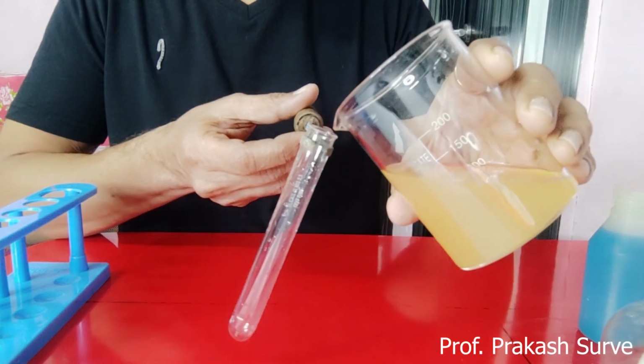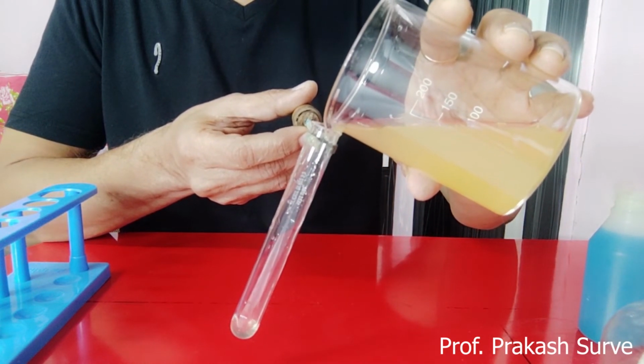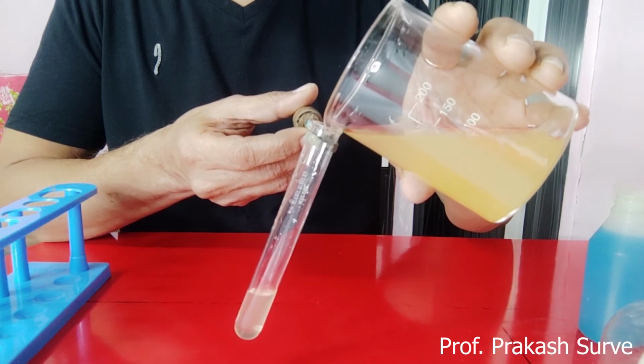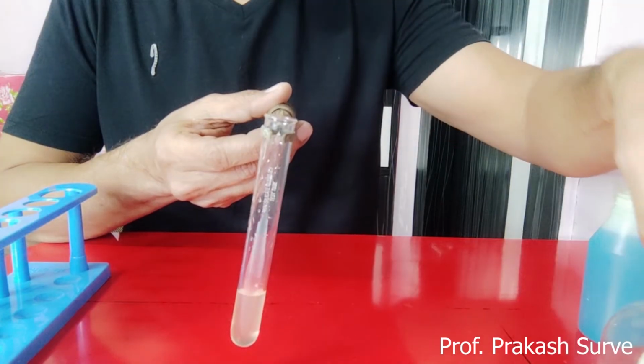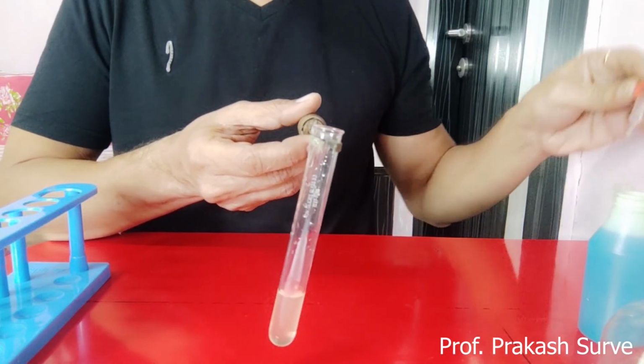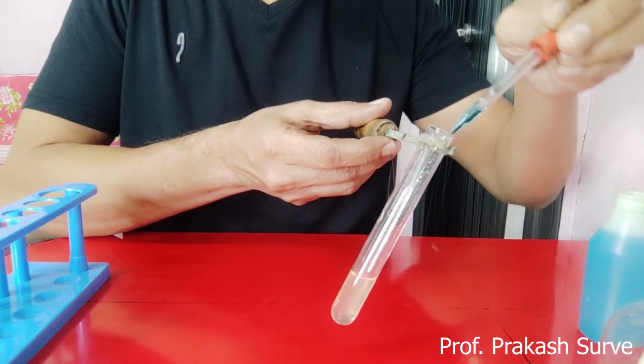So 2 ml approximately I will take, 1/4 of the test tube of the urine sample, and now in this I will add 1 ml of the Benedict reagent.